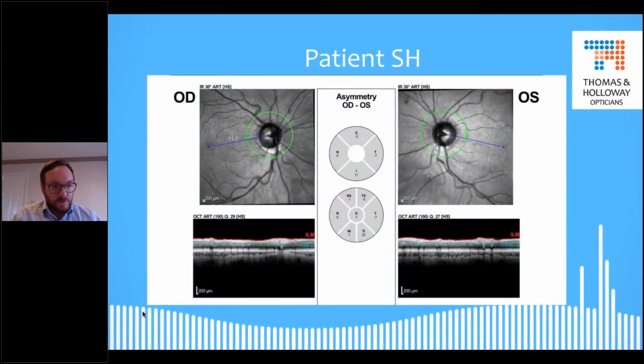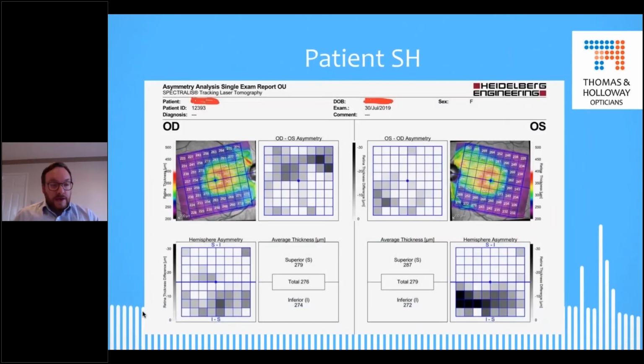These are the optic nerve heads that we see. Again, there's nothing drastic here. There's possibly a slight asymmetry in the optic nerves, but to me, there's nothing overly drastic there at all. So consistent with what we found from our clinical examination through Volk. So on the surface, things are looking all okay. Next, we drill down into the retinal thickness scans.